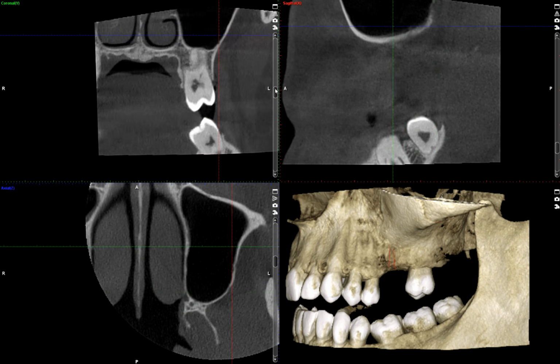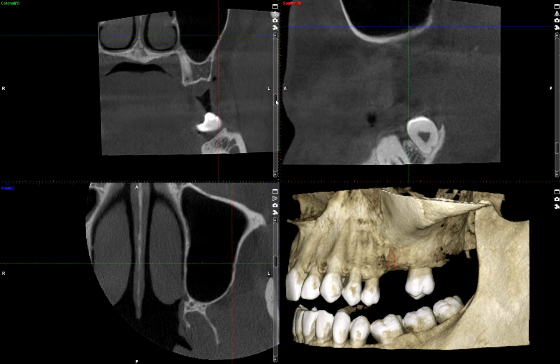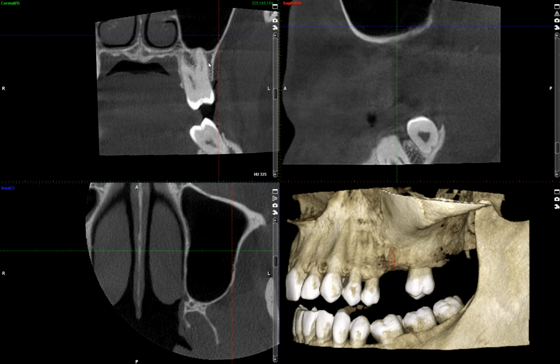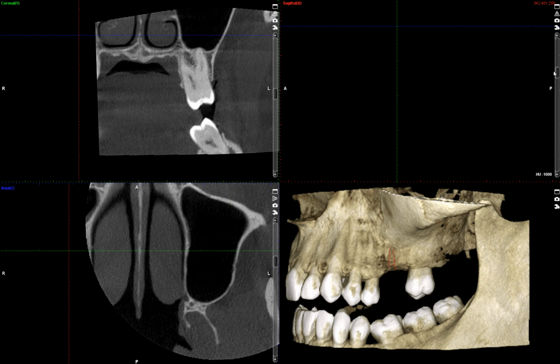So yes, I have to read all of that. I have seen cases of developing malignancy along the palate. I have seen cases of squamous cell carcinoma in the maxillary sinus. So yes, you absolutely want to visualize the entire scan.